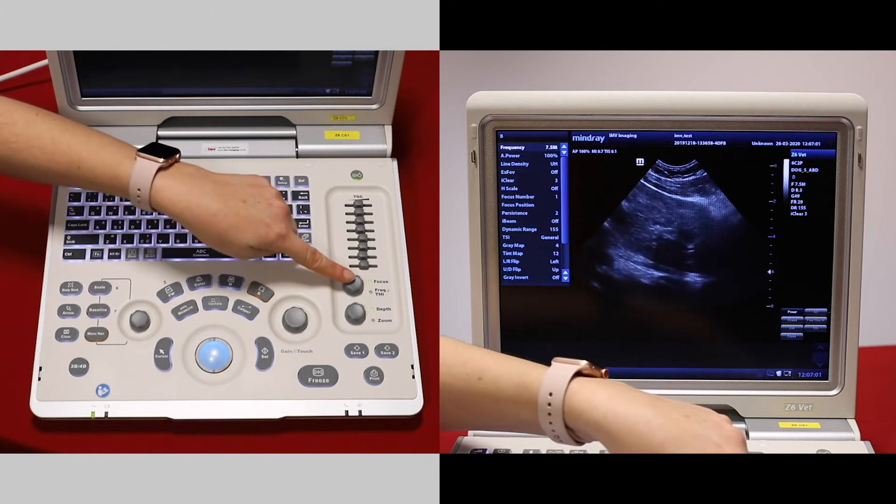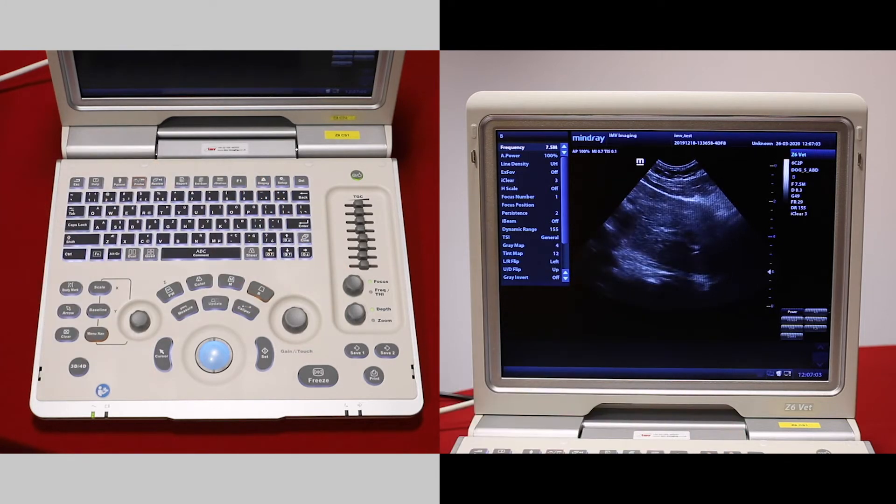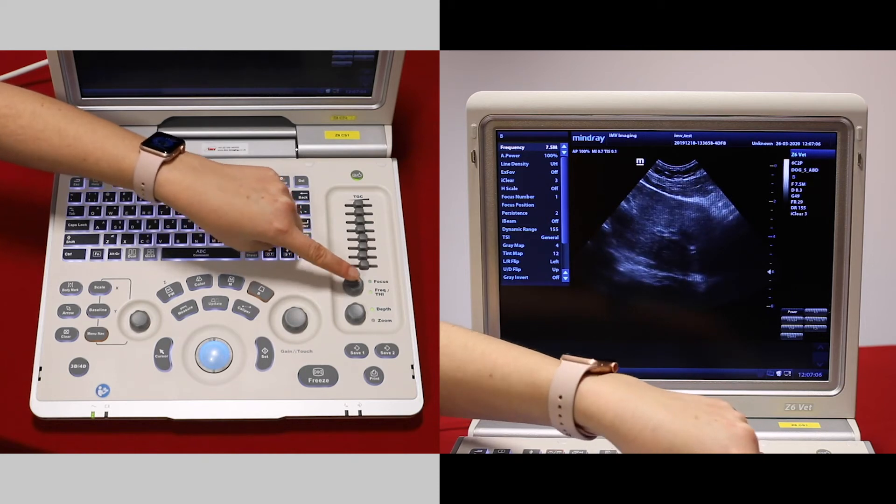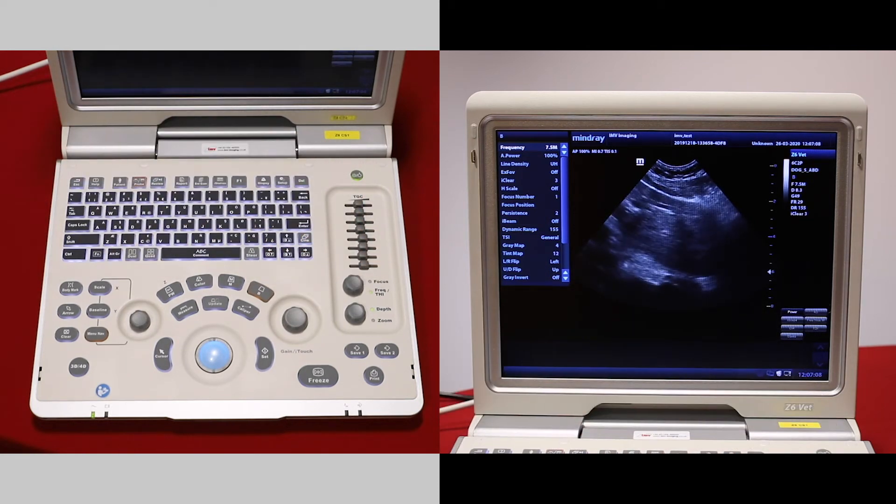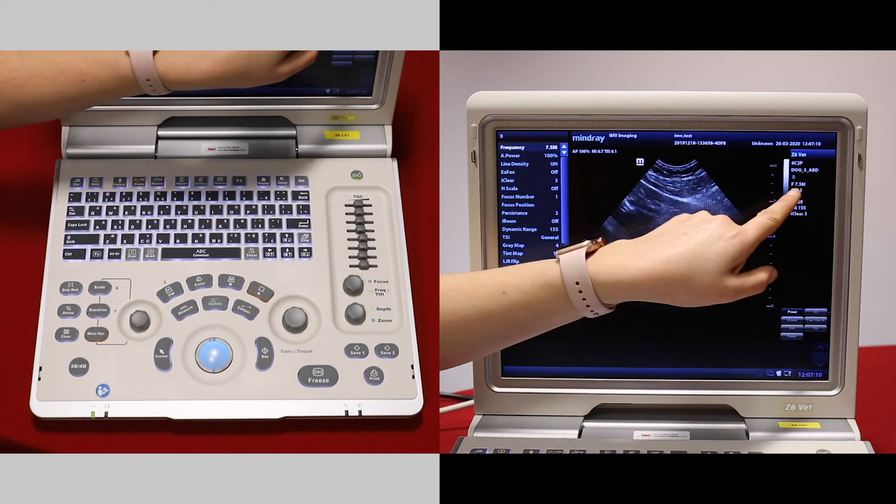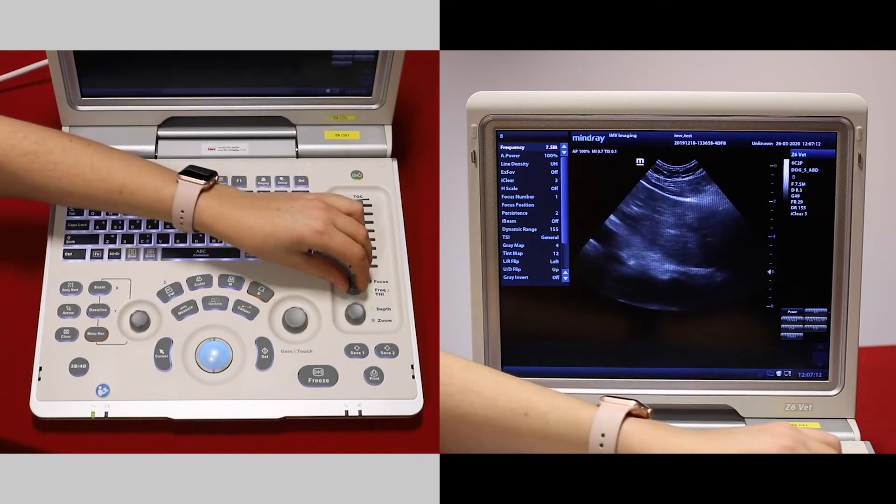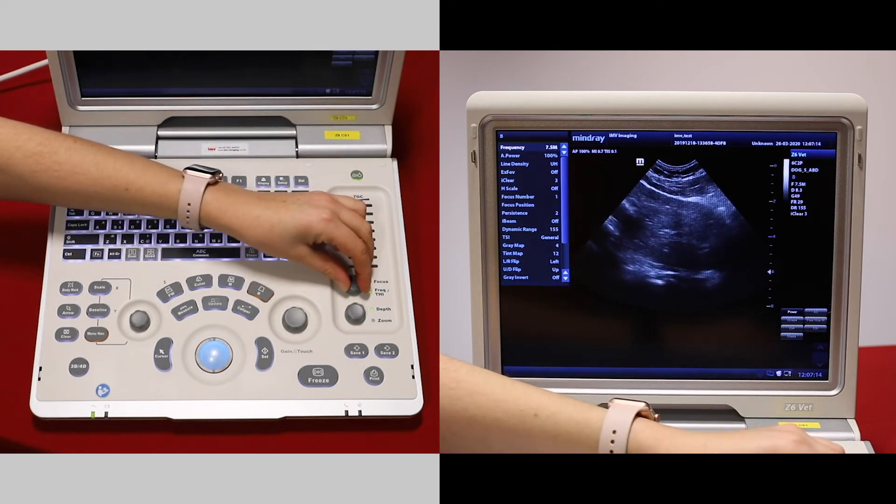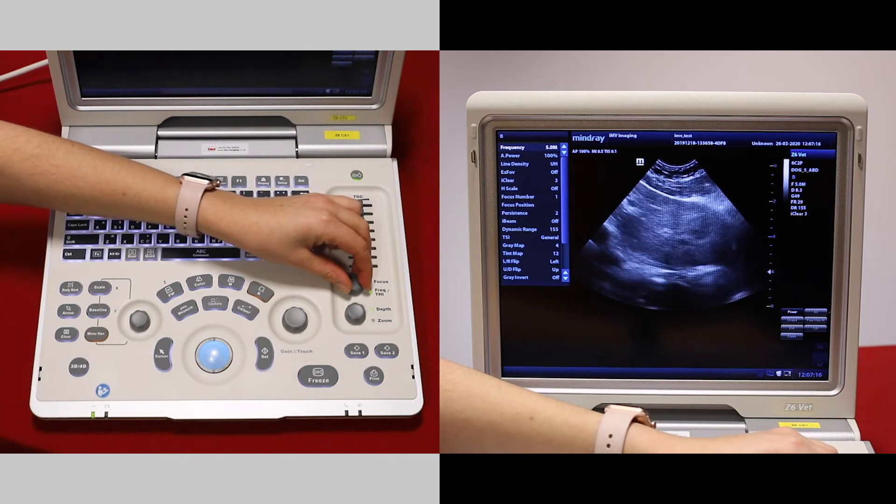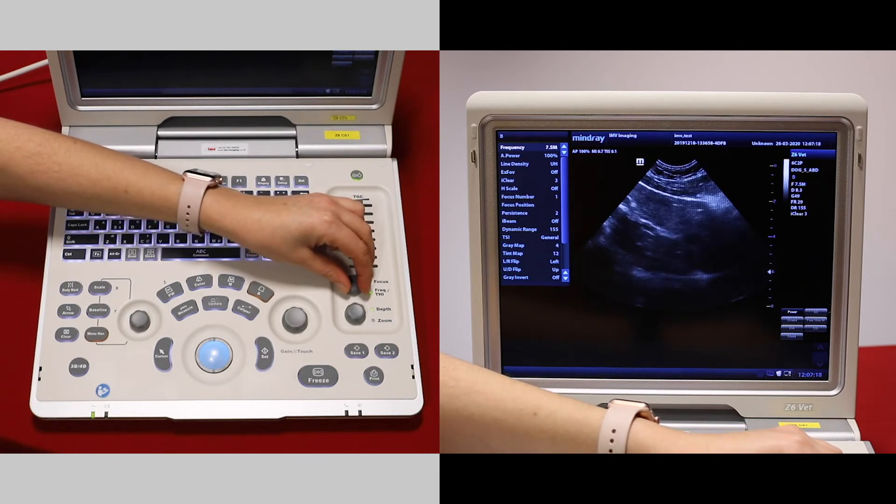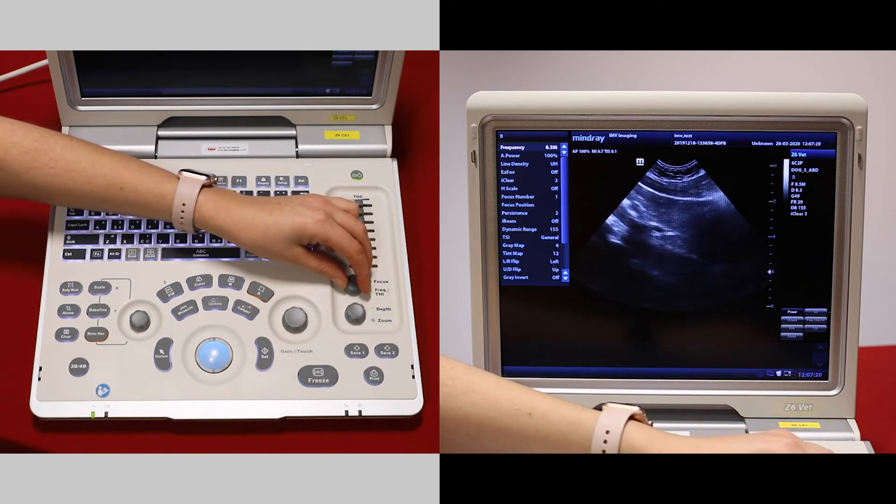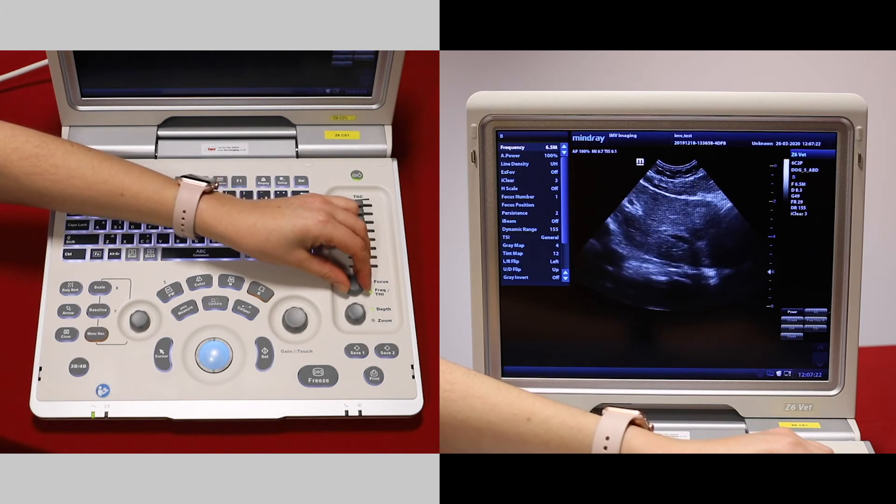The frequency and focal point button are on the same button here. Press this to change the frequency highlighted here. The frequency is also displayed on the screen. We can then increase or reduce the frequency. Increasing the frequency will give us better image resolution, but reducing the frequency will give us better penetration.